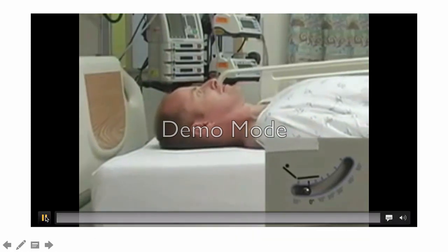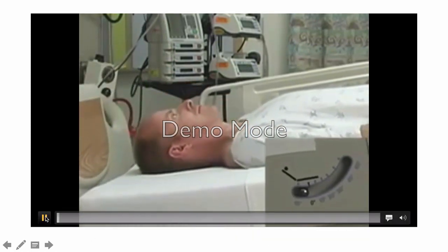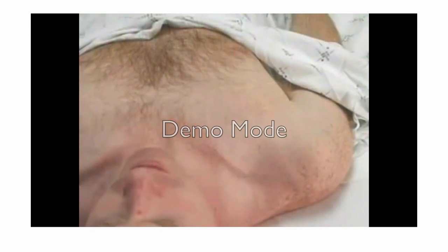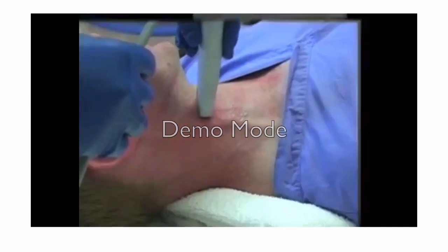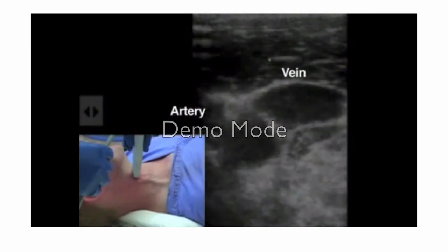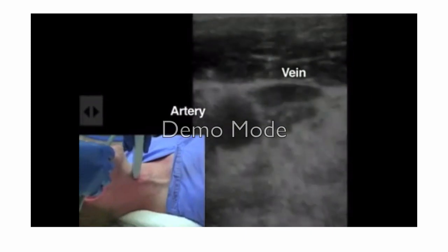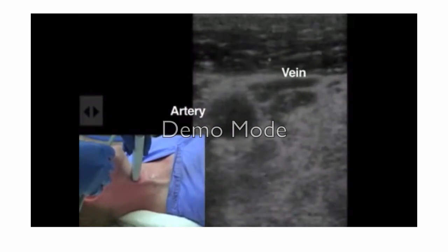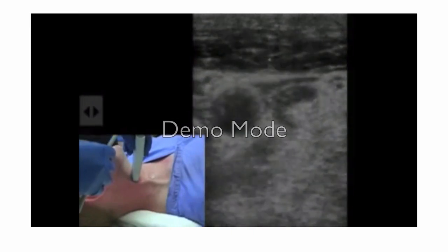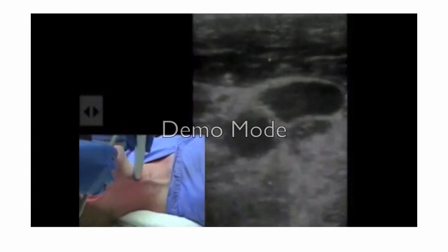Here we go. With internal jugular, you need to position your patient in a Trendelenburg position, like 10 to 15 degrees. Ask him to turn his chin to the opposite side, and with the help of the ultrasound, try to locate your vein so you can do the freezing and just to have a quick examination of the targeted vein.